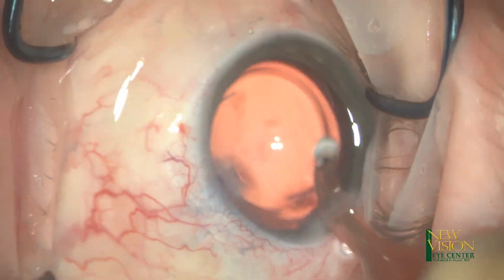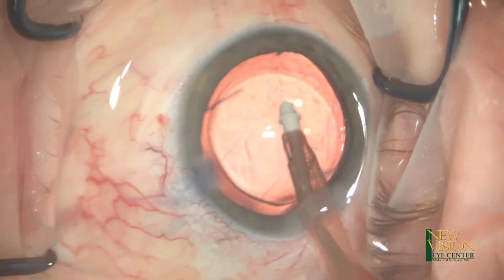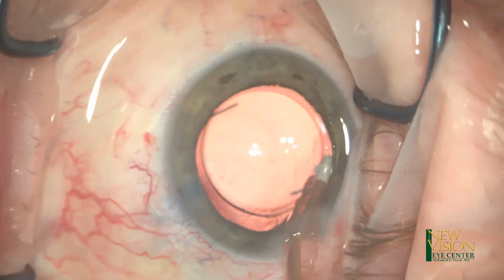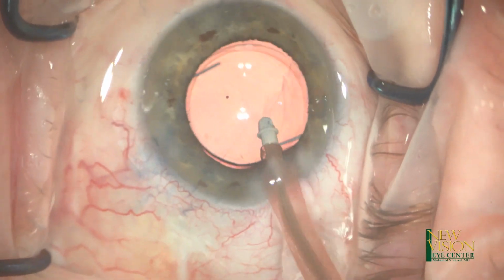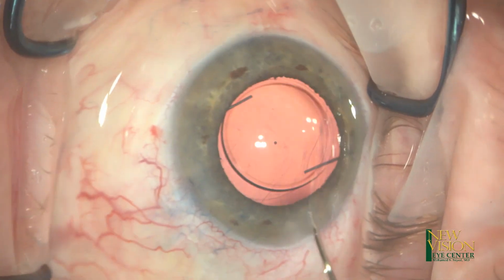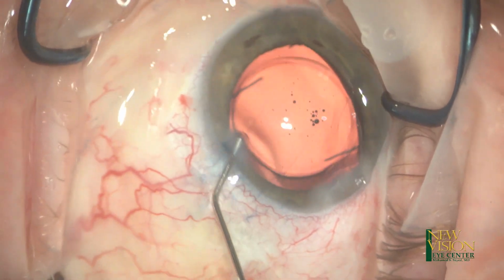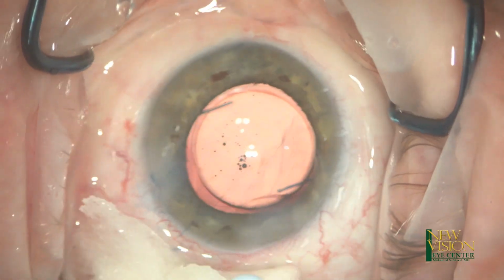Now the entire lens is in the bag, both haptics are in the bag, and I remove viscoelastic from behind as well as anterior to the lens, and I try to mechanically bring the pupil diameter down, and I hydrate the incision and make sure that the IOP is good, no leakage, looks good to me.